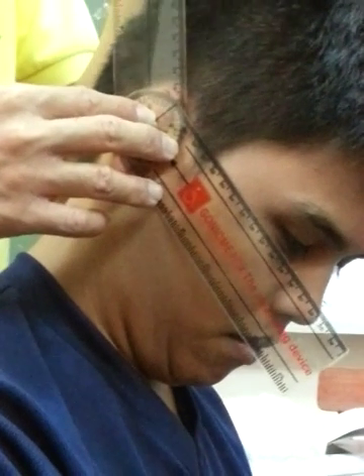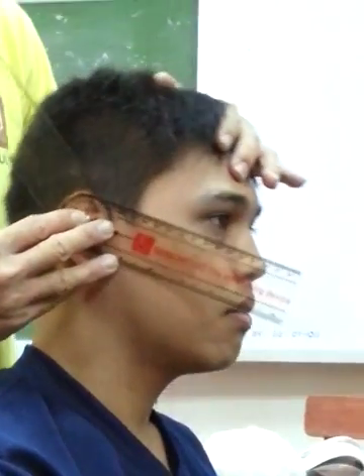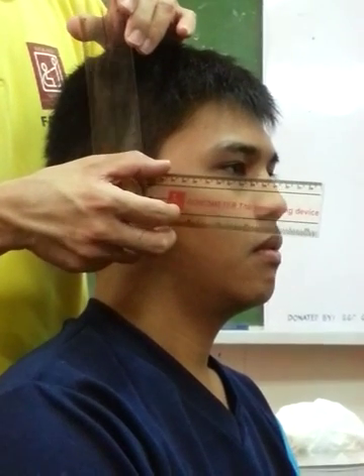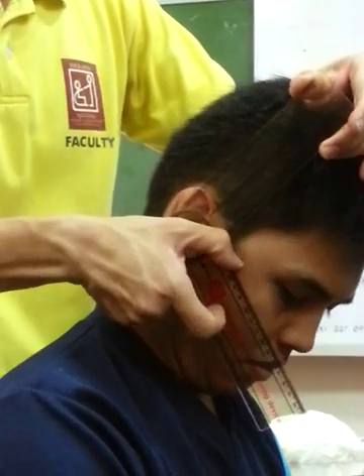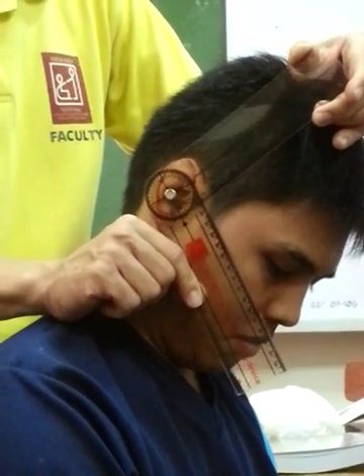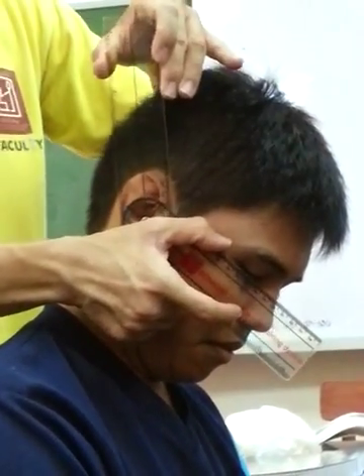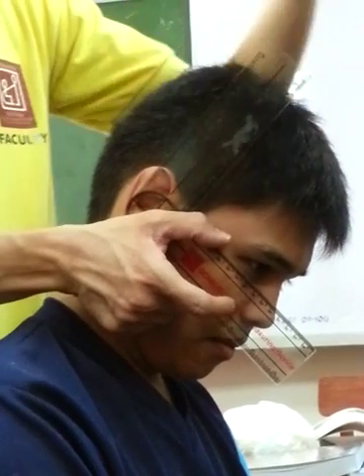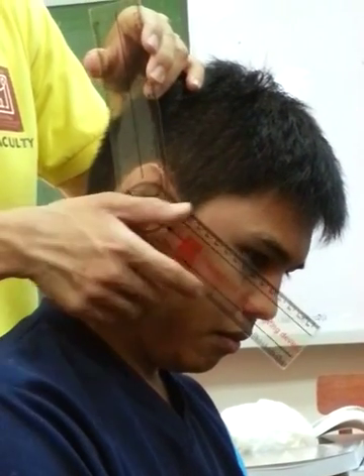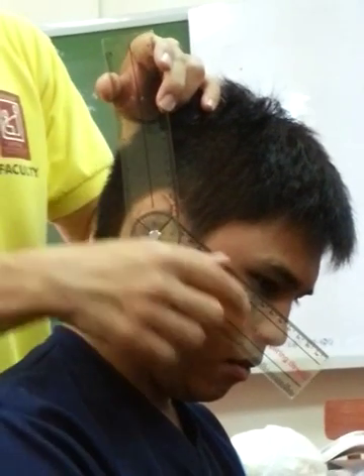The common mistake is that the stationary arm moves when the patient bends. Observe — when the patient bends, the stationary arm should not move at all. There is only motion in the distal arm. If the stationary arm moves, that is a mistake. It should remain straight — perpendicular to the ground — throughout the entire motion.